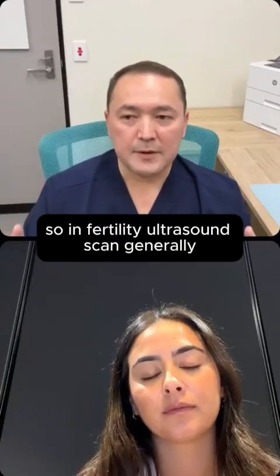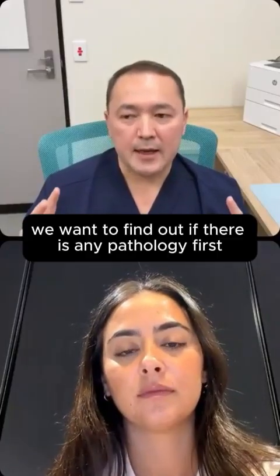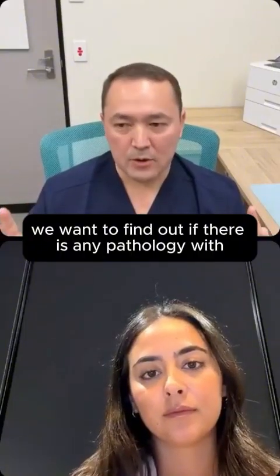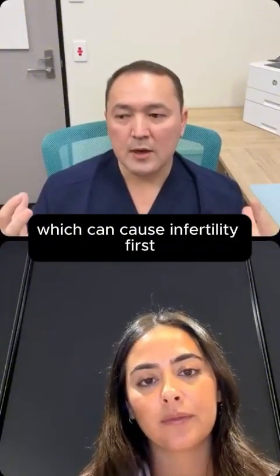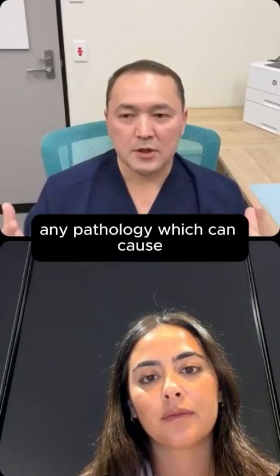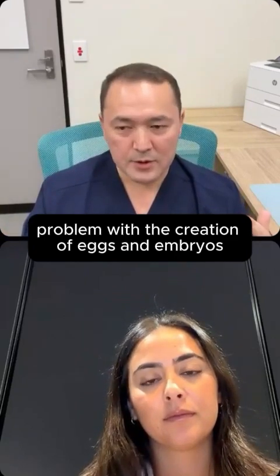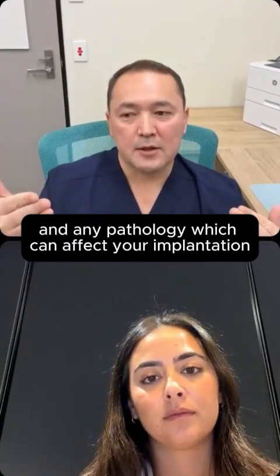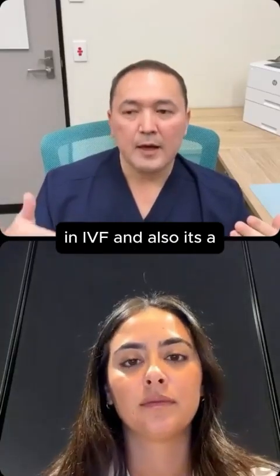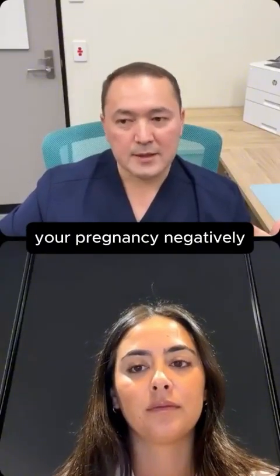In a fertility ultrasound scan, generally we want to find out if there is any pathology which can cause infertility, any pathology which can cause problems with the creation of eggs and embryos, any pathology which can affect your implantation in IVF, and also any pathology which can impact your pregnancy negatively.